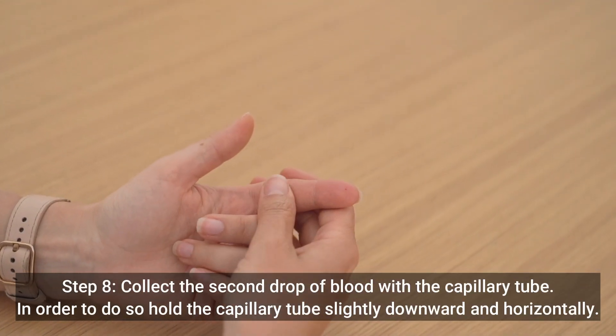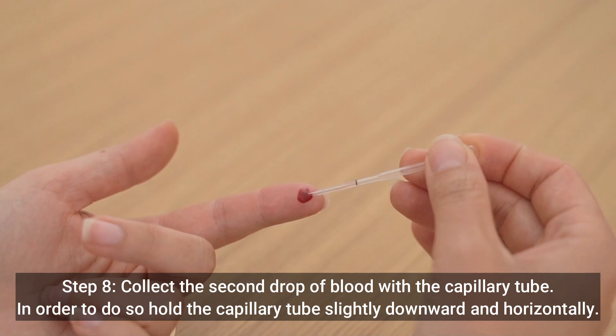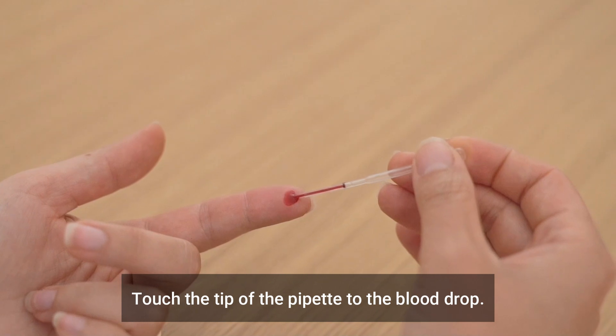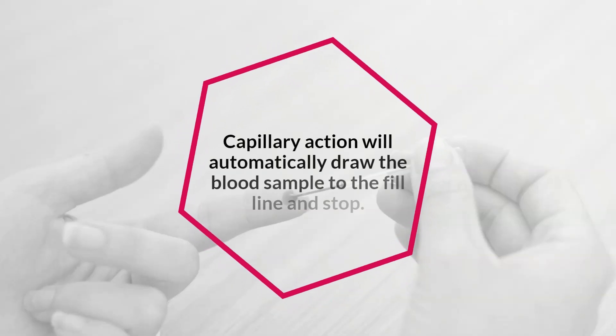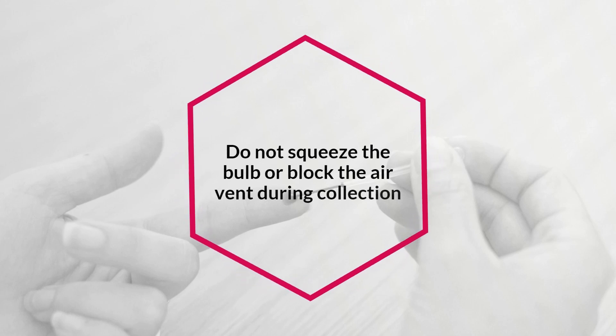Step 8: Collect the second drop of blood with the capillary tube. Hold the capillary tube slightly downward and horizontally, and touch the tip of the pipette to the blood drop. Capillary action will automatically draw the blood sample to the fill line and stop. Do not squeeze the bulb or block the air vent during collection.